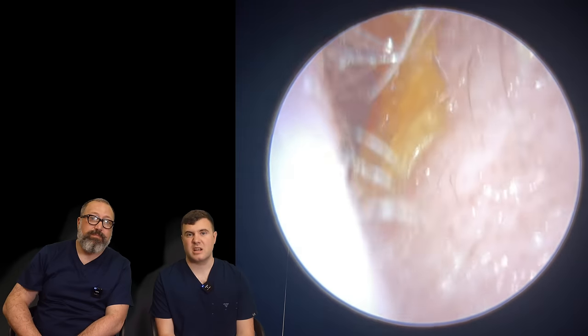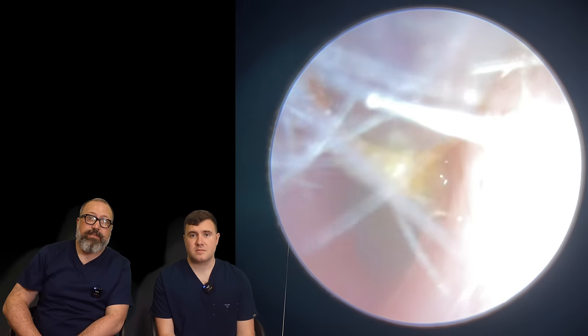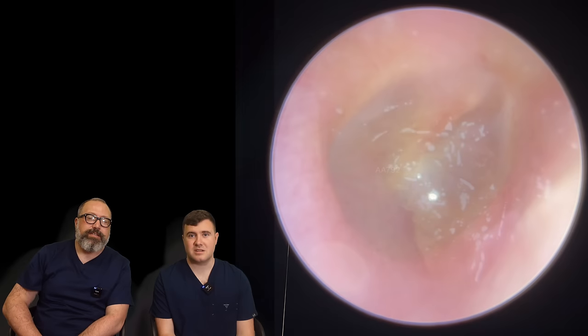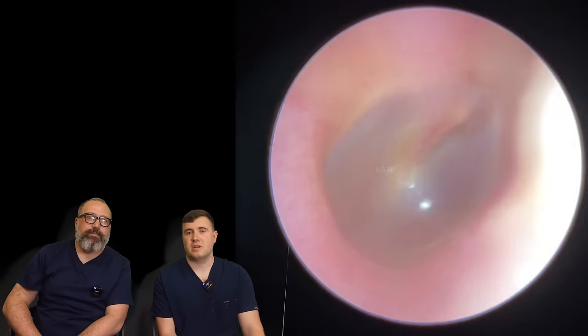Just pull most of it, just a little bit left. Look at that go — whoosh, just all sort of imploded into the suction tube as soon as you've got a grip on it. Eardrum looking nice and healthy. Perfect. So that's looking good in there. Instant relief.